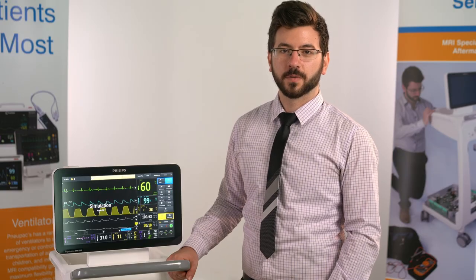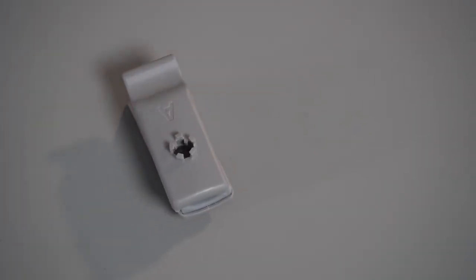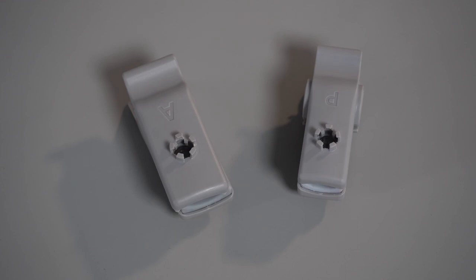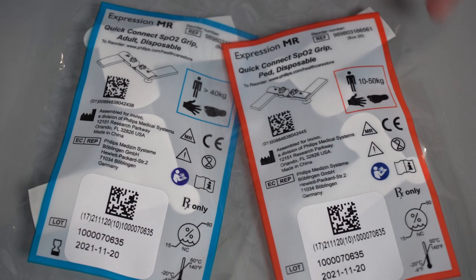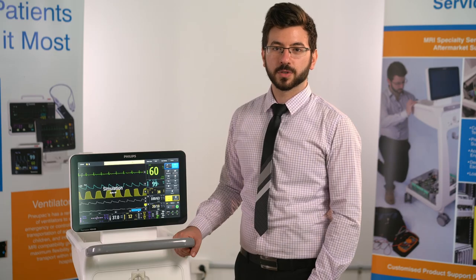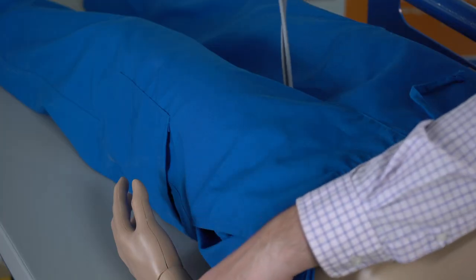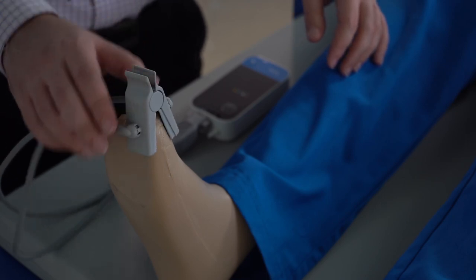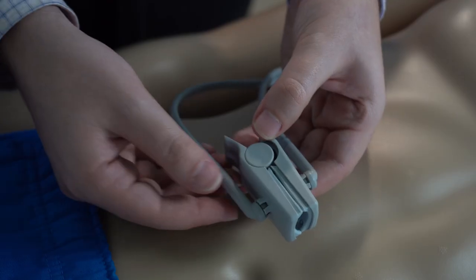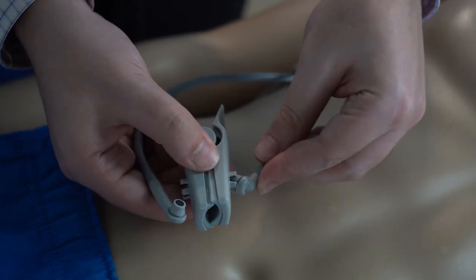With the module ready for use, first choose which SpO2 clip you want. Reusable clips come in adult and paediatric sizes. Disposable clips come in a variety of sizes which include adult, infant, paediatric and neonatal. Disposable clips are more secure and tend to work better on patients that move about. When placing the clip on your patient, only handle the clip itself and not the cables. These cables are fiber optic and prone to damage. Always pull from the reinforced tips when changing clips, not from the cable itself.